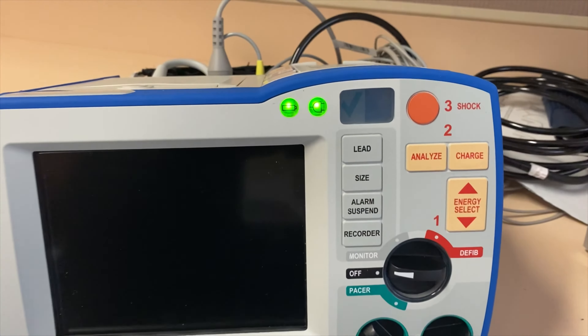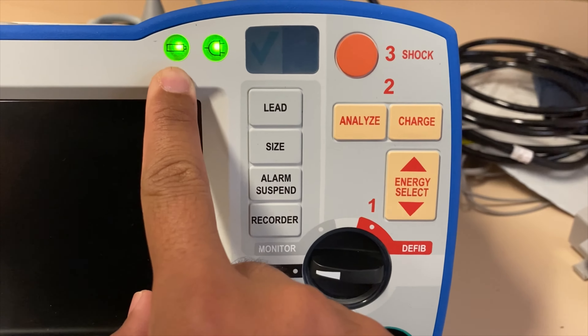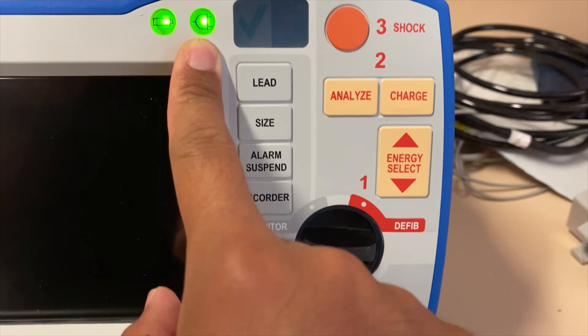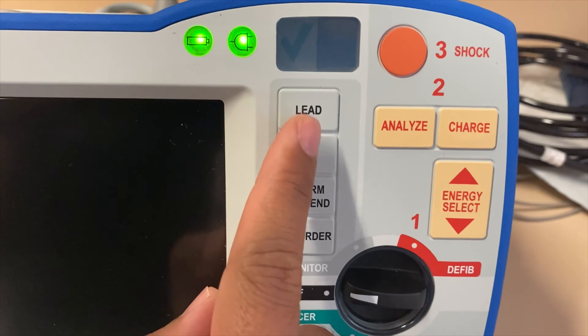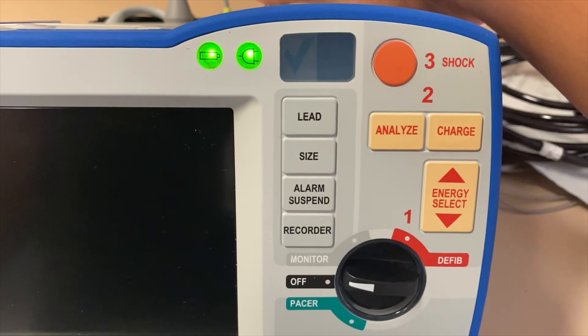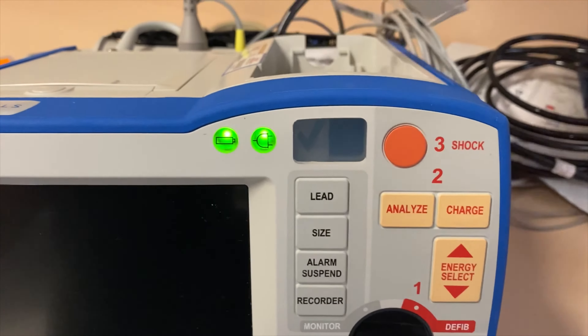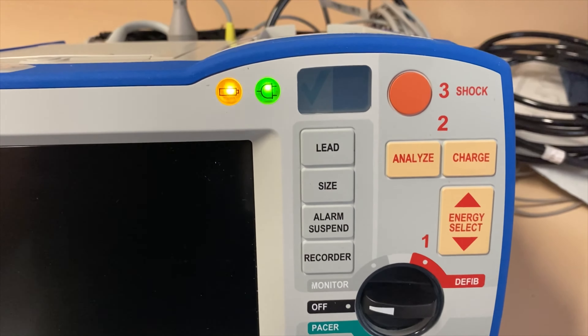Let's look at the front part of your monitor. You would see this is your battery and this is your outlet or your plug. When both are lit green, that means they are plugged in and have battery. Once I take off the battery from the top, note that the battery light will start blinking orange or yellowish.